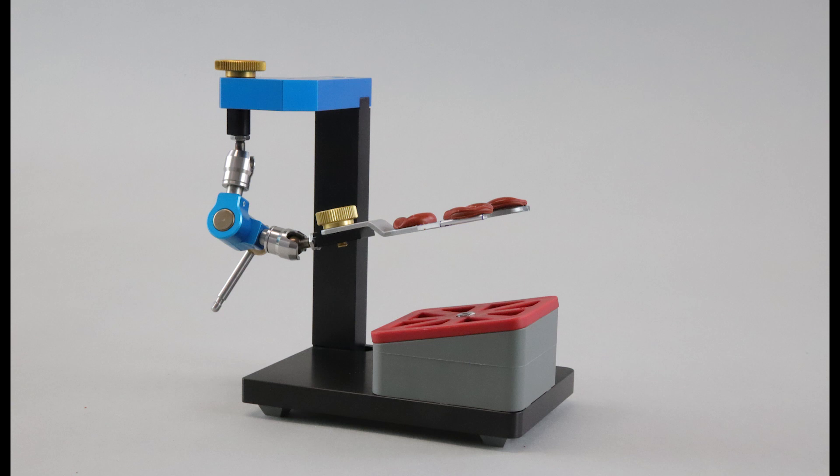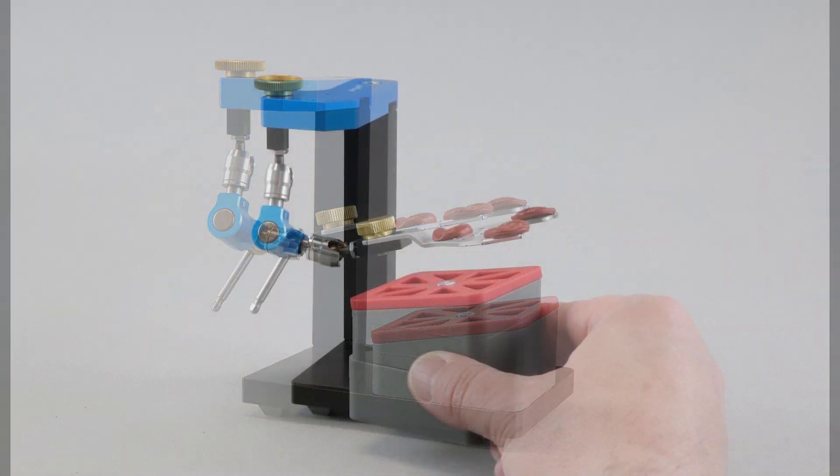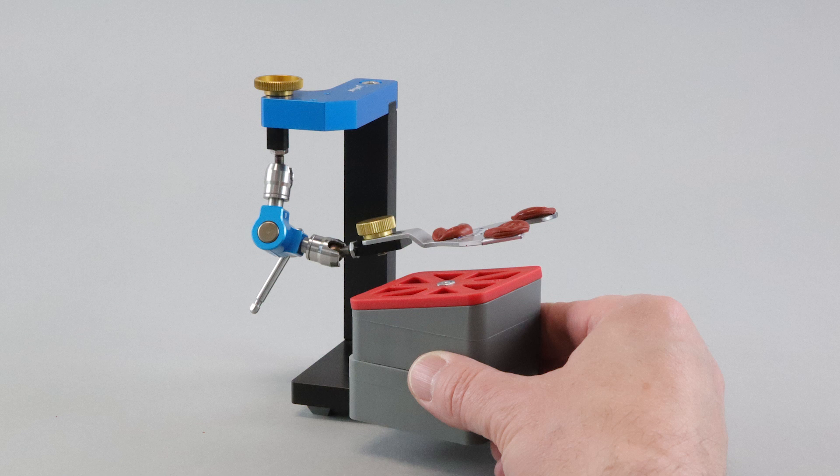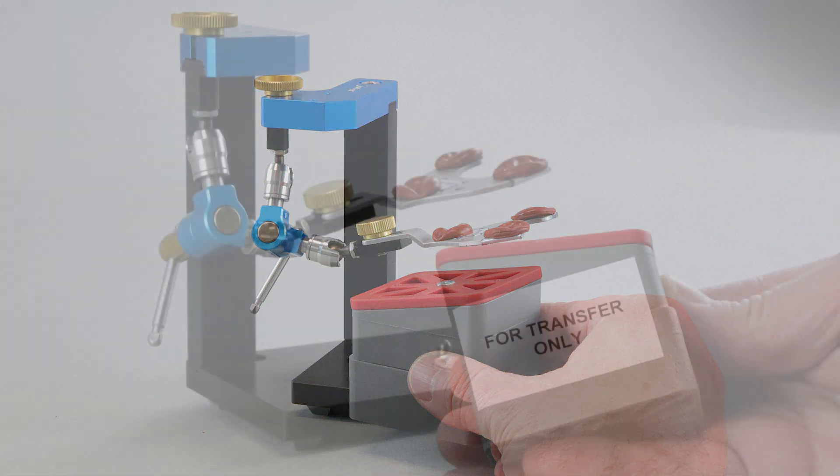The distance block with mounting plate serve as the transfer table for the bite fork. There should be minimal space between the distance block and the bite fork. Choose the distance block size which fits best.